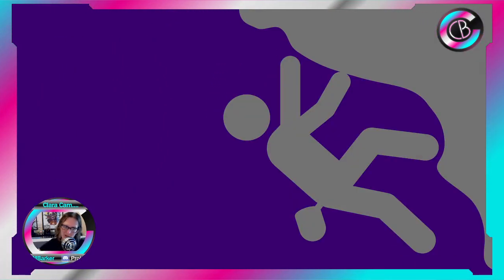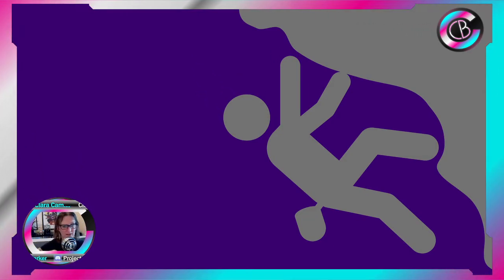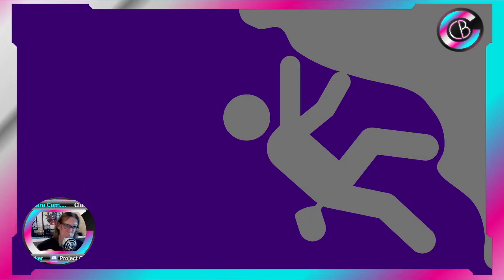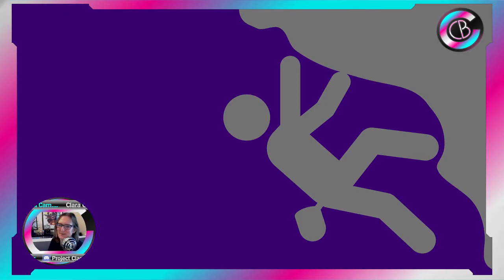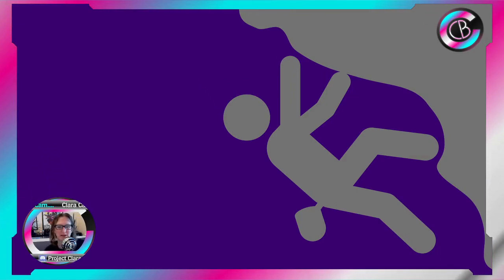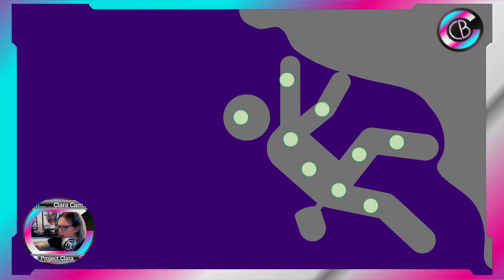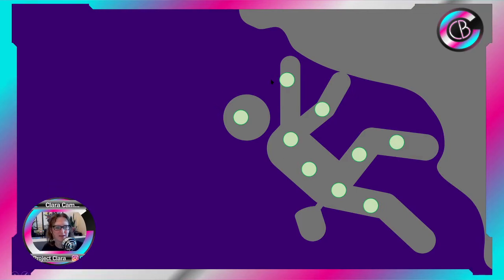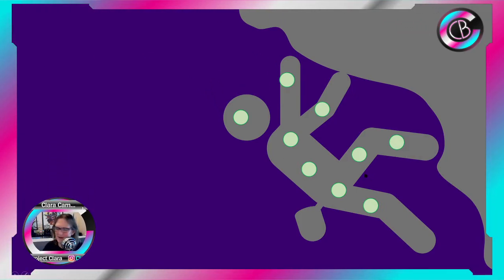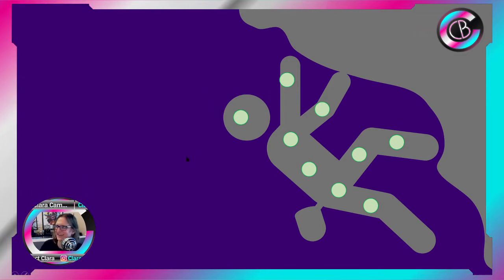Let's take a person. So this is Clara. Clara is rock climbing, and Clara might have a fall and end up in an MRI. Might have happened, might not have done. Who knows? Anyway, the human body is actually made up of an awful lot of water, and so a lot of hydrogen. We've got all these hydrogen atoms in us. Loads and loads of them. So our body is made up of loads of hydrogen atoms, more than the 10 that you've got on screen, I should point out.